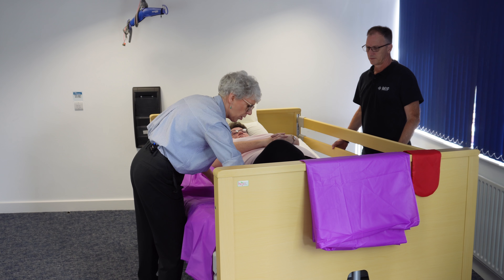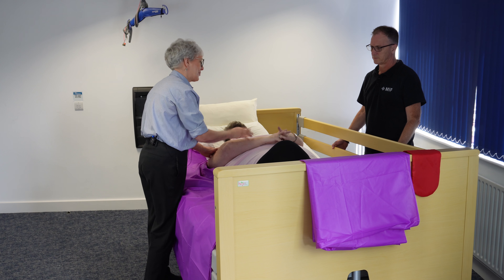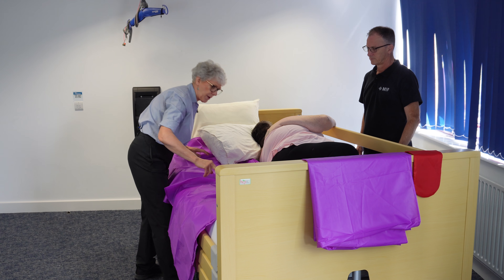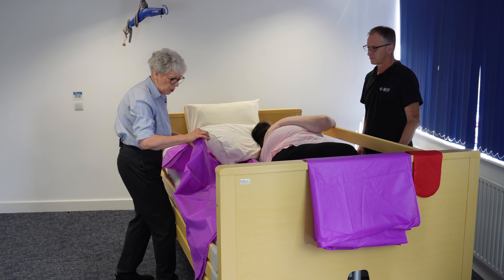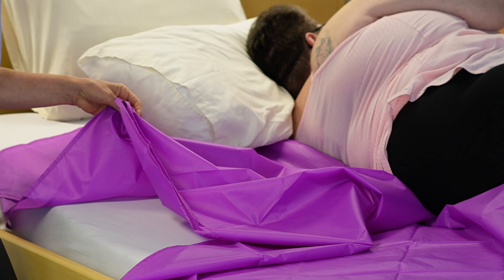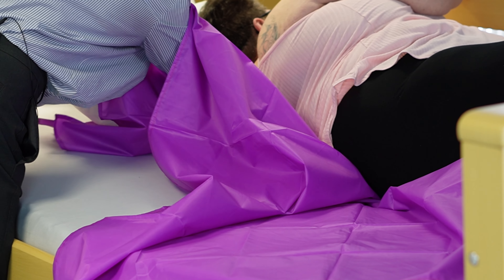The roll on this one is just facing downwards, so I'm going to ask Lou to help here. If you'd like to bend your knee up, then I can just roll her over a little bit. From here we just place the slide sheets underneath, and to make sure it's tucked under a little bit, I'm going to hold both layers together and push down and underneath Lou — pushing down into the bed.